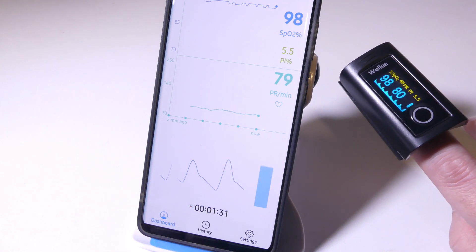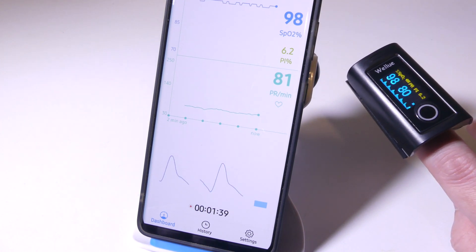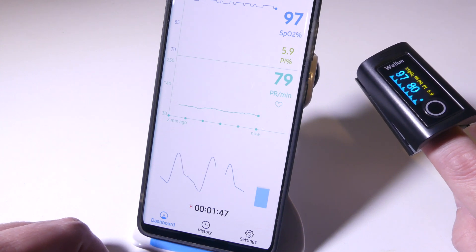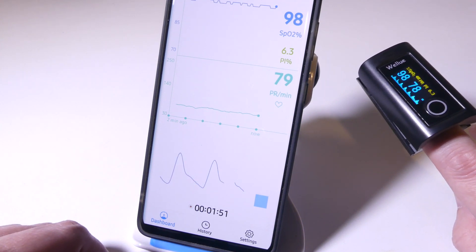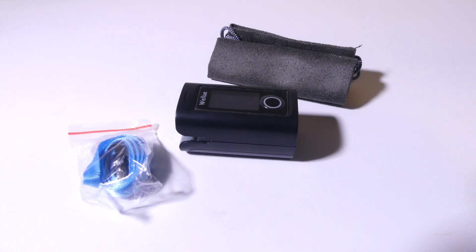Especially if you're going to monitor a child, an older adult, or somebody with COPD — there are countless reasons why you'd want to do this. Having the Bluetooth enabled device and the app where you can remotely check on someone is a really cool feature that you don't see on most basic pulse oximeters. That's my review of the WellU OxySmart Bluetooth enabled pulse oximeter. You can check it out on Amazon for $23.99 — it's very competitive and actually has Bluetooth functionality, which really sets it above your basic oximeter. You can use the app for yourself and have information to show your doctor.